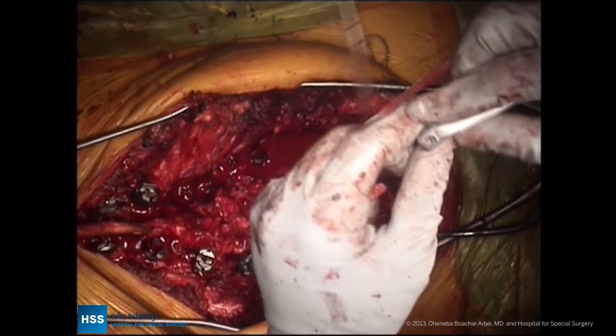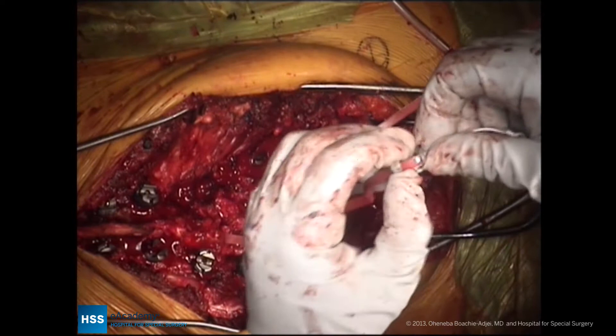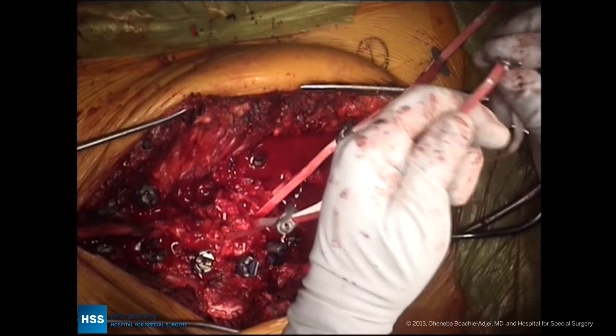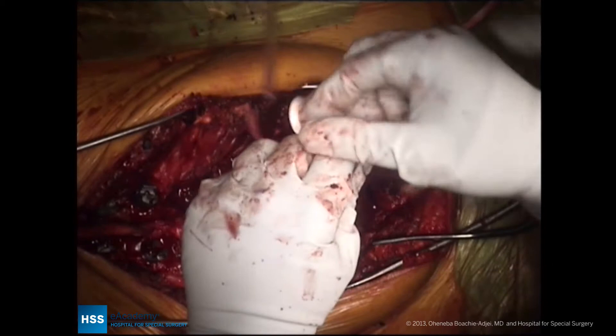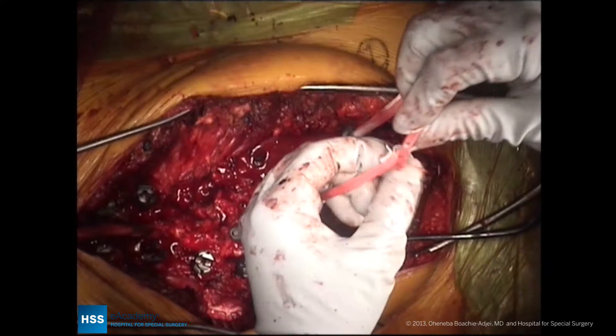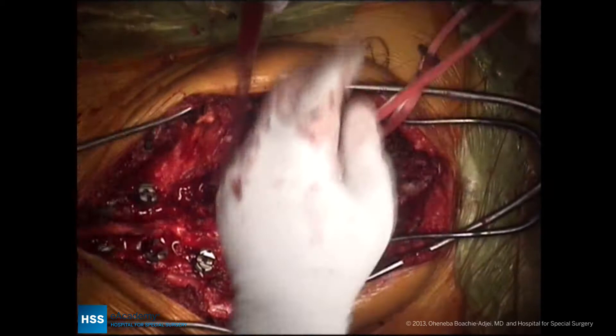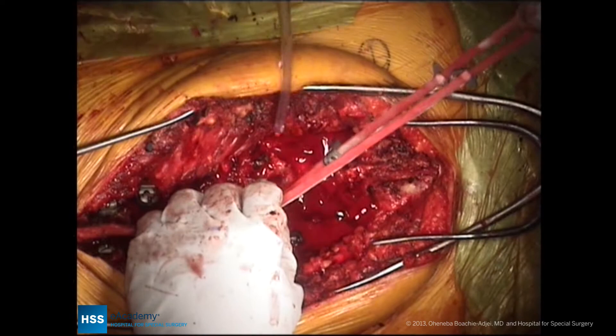The tape goes through the first eye, then through the second eye of the base of the clamp itself, then loops over itself and back in — this is where it will provide the lock-in. When it's turned over the split eye of the base of the clamp, that allows the lock-in mechanism. So now it is locked, but can still be advanced with a special instrument, after the rod is attached to the band clamp portion.